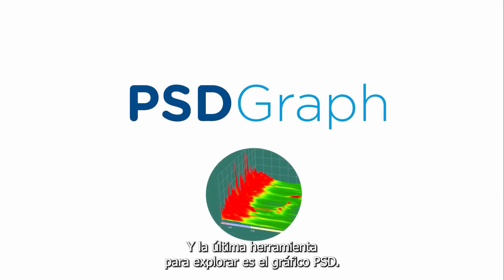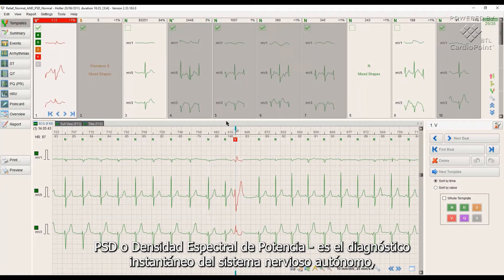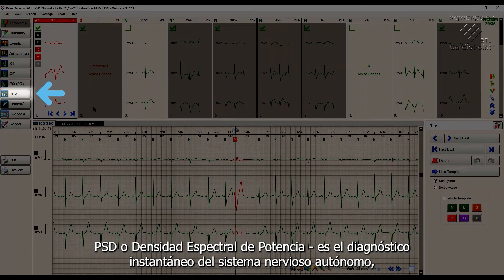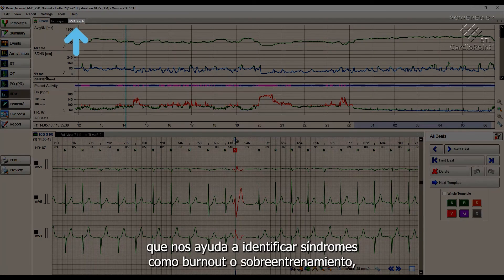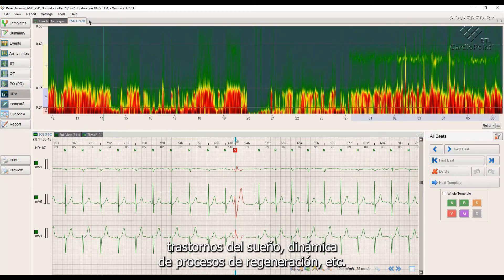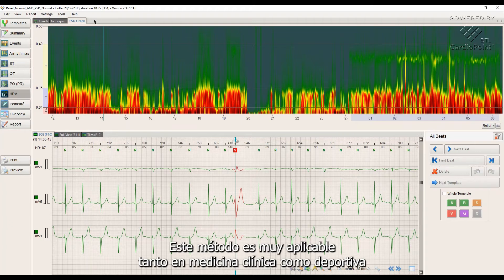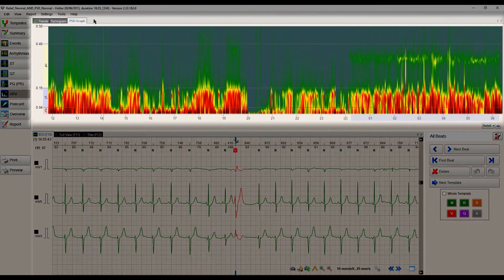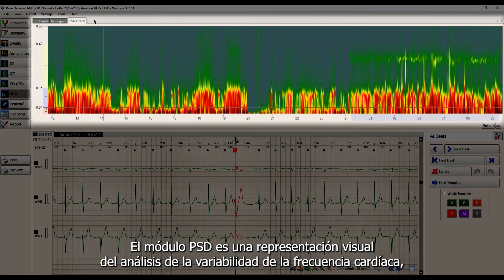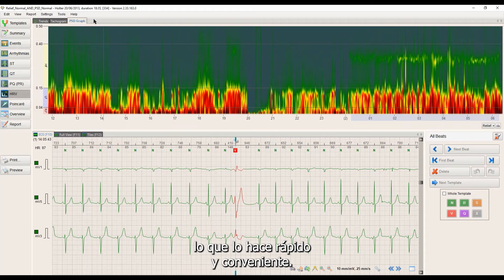The last tool to explore is the PSD graph. PSD, or power spectral density, is an instant diagnostics of the autonomic nervous system, which helps us to identify burnout or overtraining syndromes, sleep disorders, regeneration process dynamics, and more. This method is very applicable both in clinical and sports medicine to assess the quality of training and recovery processes. The PSD module is a visual representation of heart rate variability frequency analysis, which makes it fast and convenient.